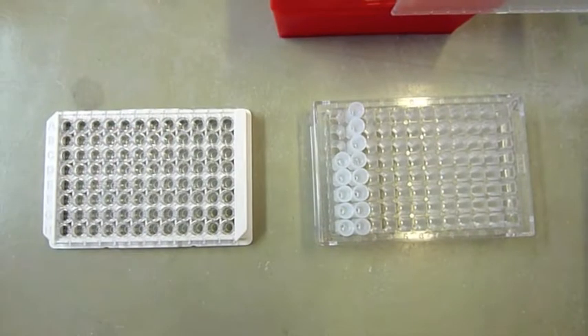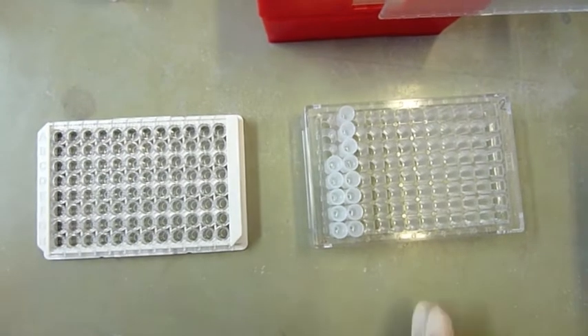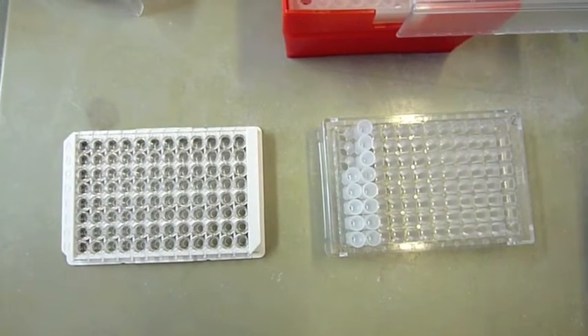This is the setup for dispensing the pre-diluted sample to the microplate, and three positions are left open here since the controls are ready to use.